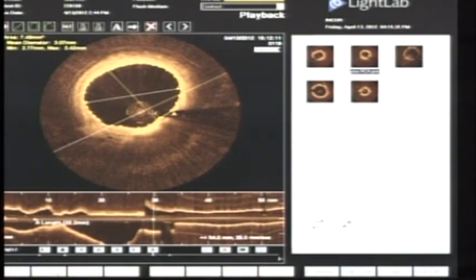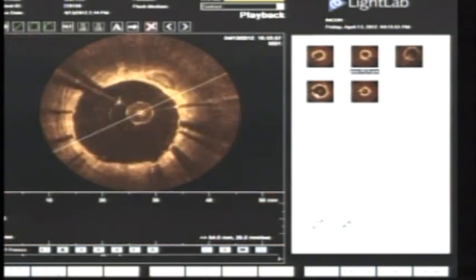I derive information, I just don't know how to act on it. I think it's going to take us time to really see whether we should act, just like you're saying, stents apposed, not apposed, should we do something? We're seeing so much more now that we don't know what the implications are and whether we should act upon everything we see on OCT.